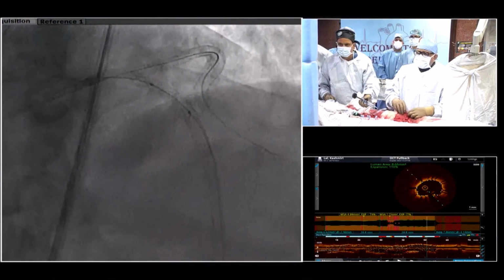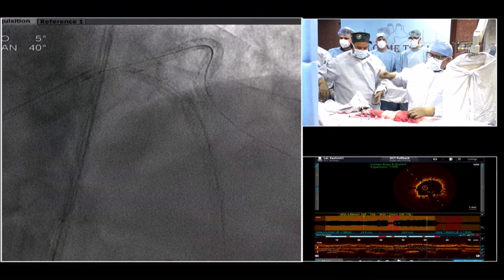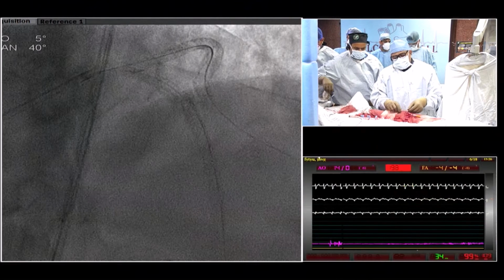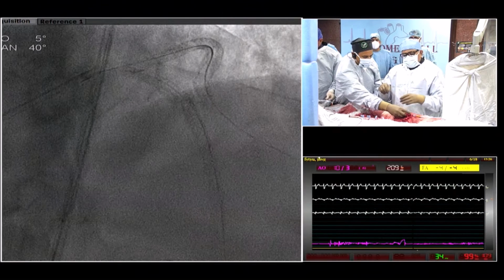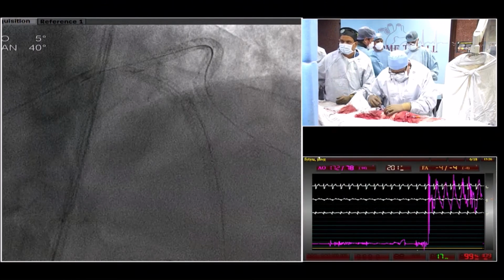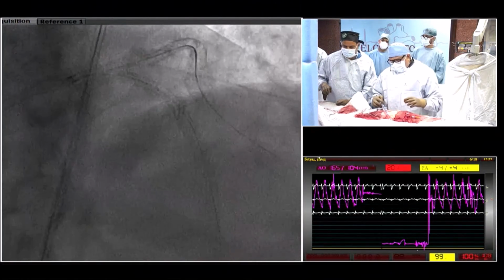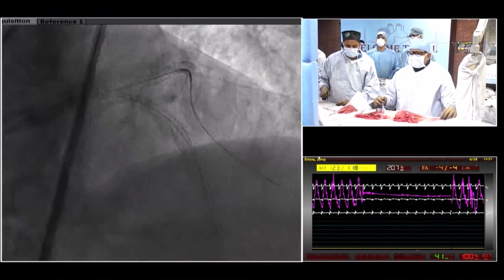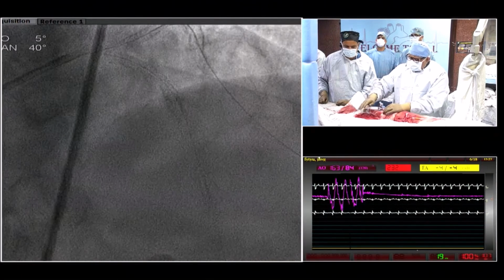Okay, so now let me post dilate it and then do the OCT. Rajesh, I think you have to look on the angiographic, remember how much improvement. There is a little bit of ectasia in the mid segment of the LAD. So maybe if you try to achieve that area, you may not be able to achieve it. The last cycle should have been at 10 atmosphere. See, mainly you have 4-6 cycle, 6 atmosphere, but usually we use the highest pressure because that is the end of the life of the IVL. So I would have gone into 8 to 10 atmosphere and finished it.